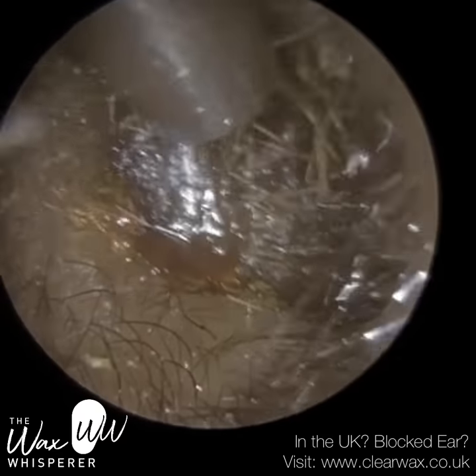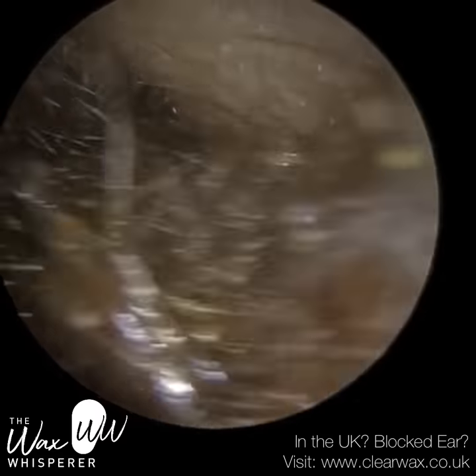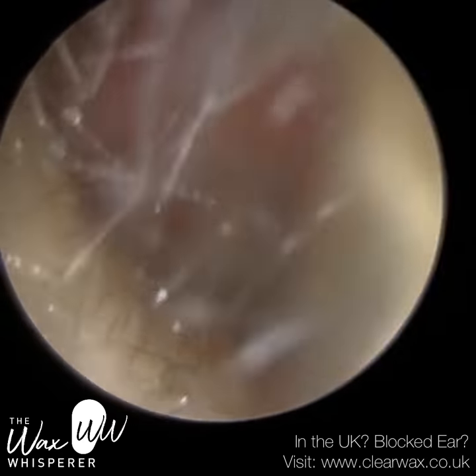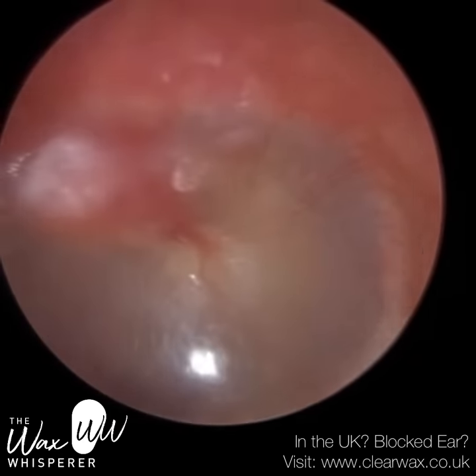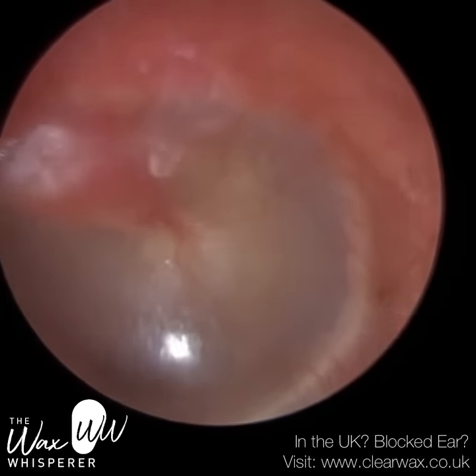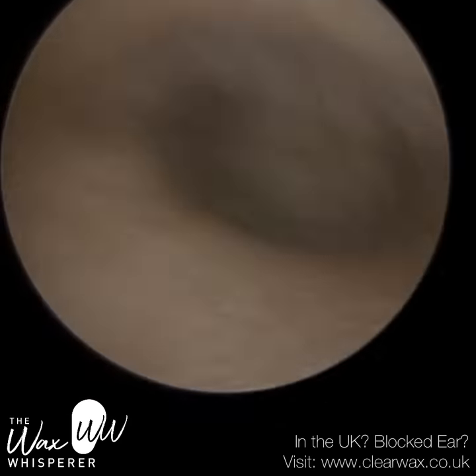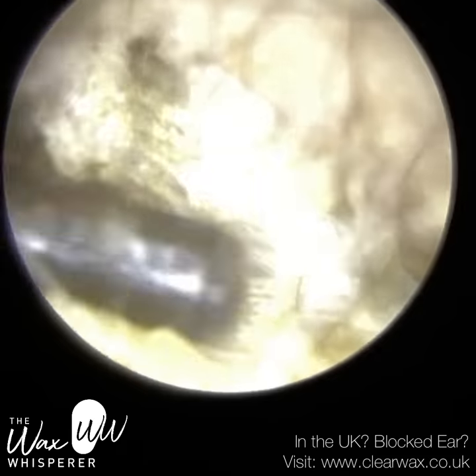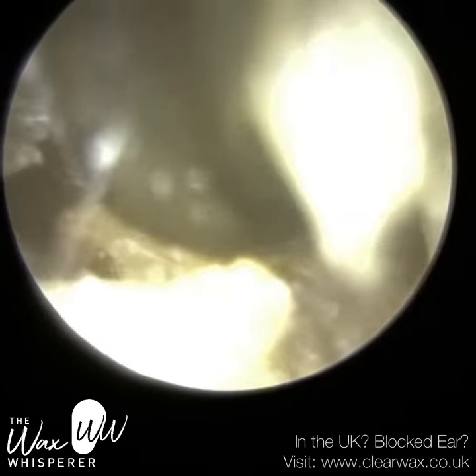An isthmus is a narrowing of some sort. In the ear canal there are two isthmusses — the first narrowing is between the first and second bend, around a centimetre within the ear canal, and then as we approach the eardrum the canal narrows and widens again. You can see that wax plug was attached to the hammer bone on the eardrum, and there was a bit of skin there. As we removed it, it just detached itself from the eardrum — that was the residual dead skin on the patient's eardrum.